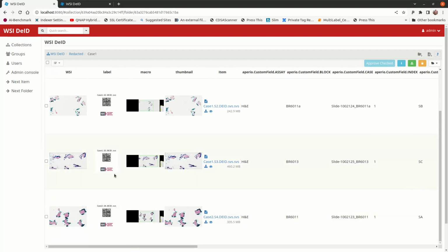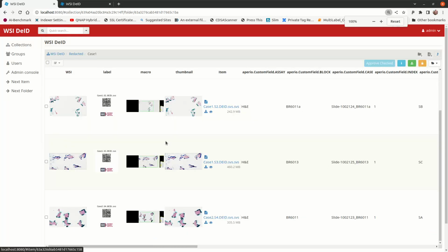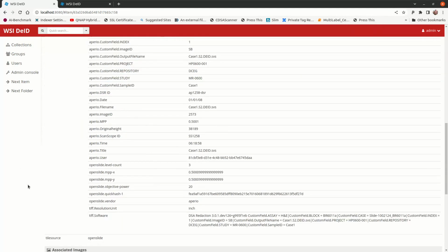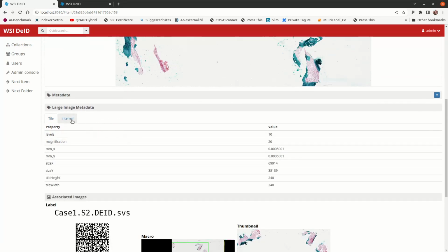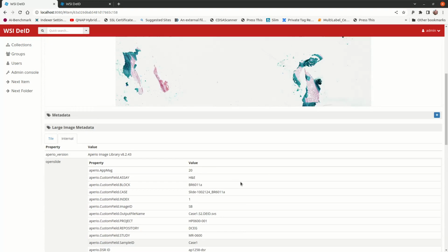No, so far no. The other thing that's really cool is the label is now customized. I threw on the NCI barcode. I put on the title, which is the file name, and then this 2D data matrix actually has encoded all of this internal data. Where'd it go? A lot of junk in here. But I just saw it. I'm sorry. Here it is.